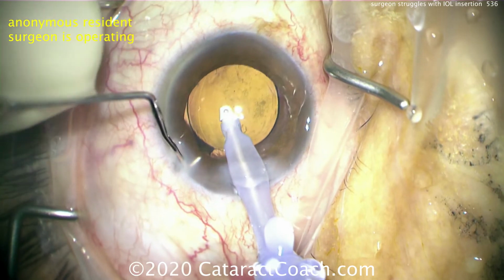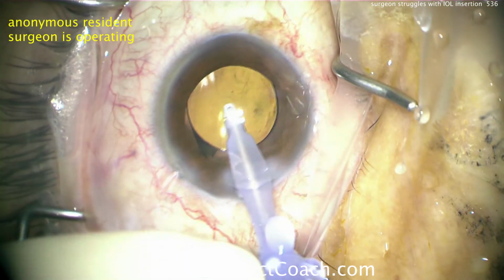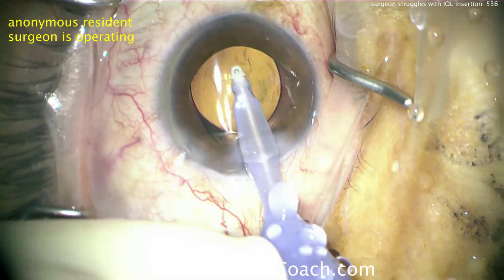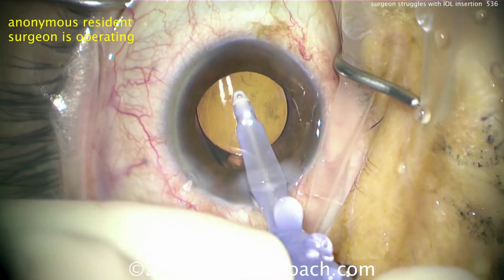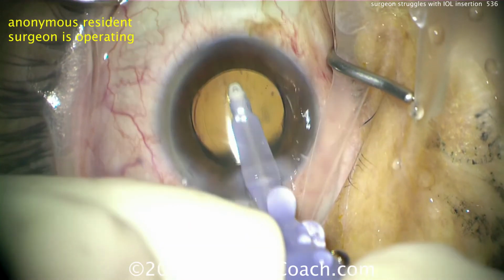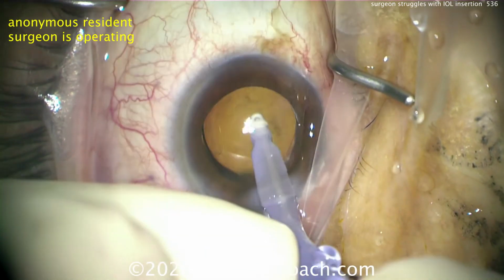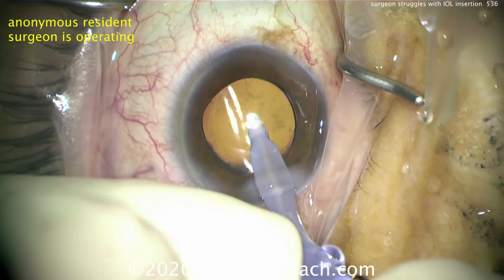The resident says, all right, let's come out of here and remove some more viscoelastic with the IA probe, getting all the viscoelastic out. Again, the haptics are in the correct orientation. The lens is not upside down. The lens looks fine. The question for you is, is this sufficient?